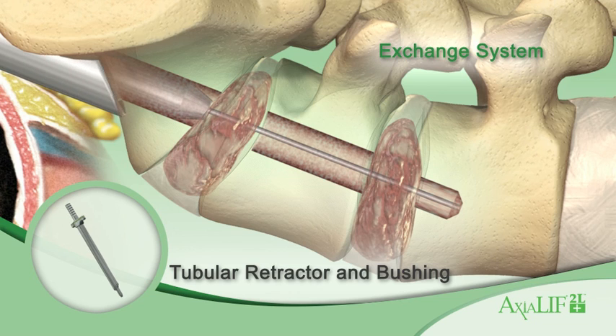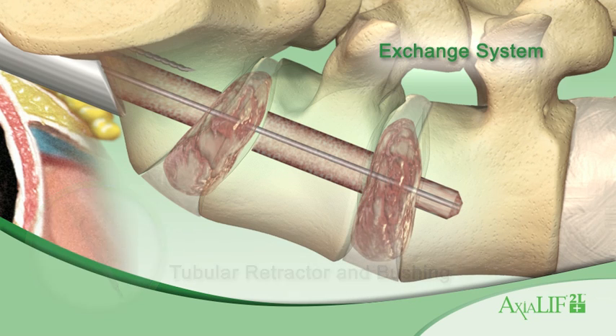The exchange bushing and tubular retractor are inserted sequentially over the guide wire. While holding the tubular retractor on the face of the sacrum, insert two fixation wires to hold the tubular retractor in place.